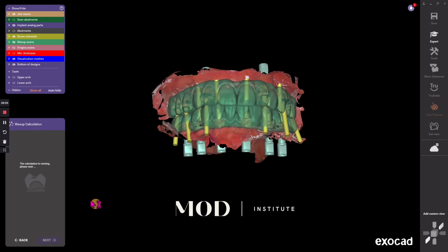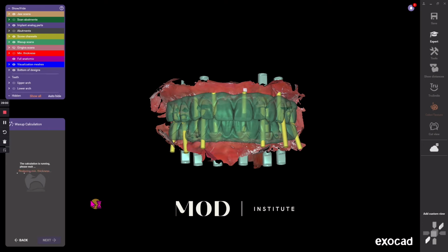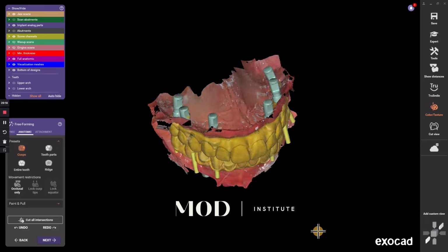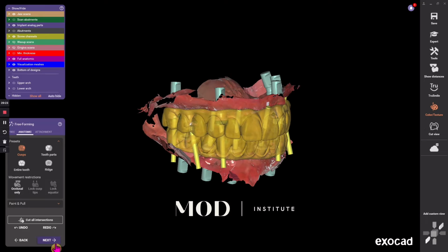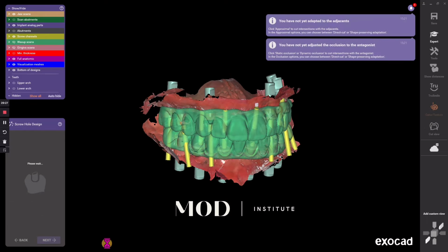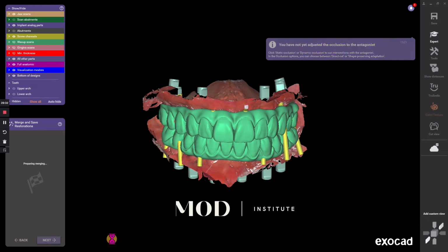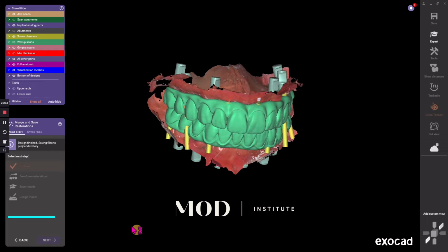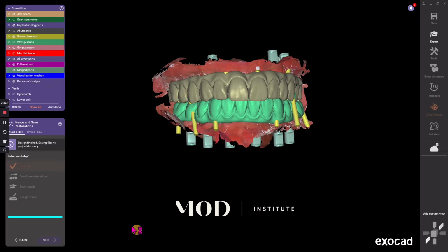So what's going to happen here is the software is going to take that wax up, which was just a solid wax up with no holes in it, and now cut the implant screw channels, the direct to MUA connection, and the perfect screw connection for their direct to MUA screw. And so let's see, I'm going to go ahead and hit next. And let's take a look at the prosthesis here once I get ExoCAD to render the final.